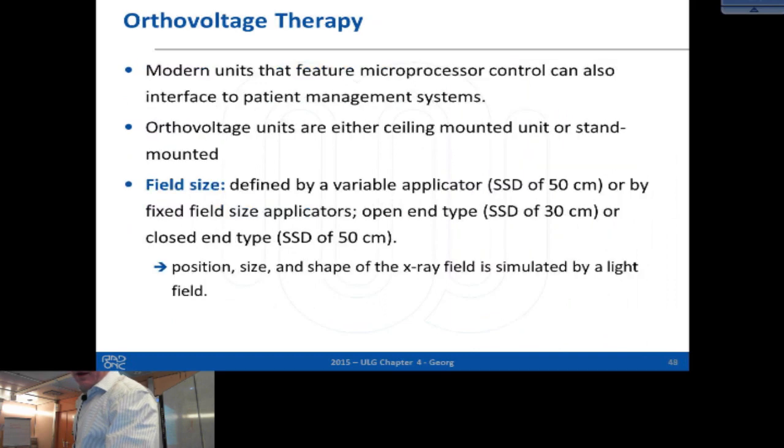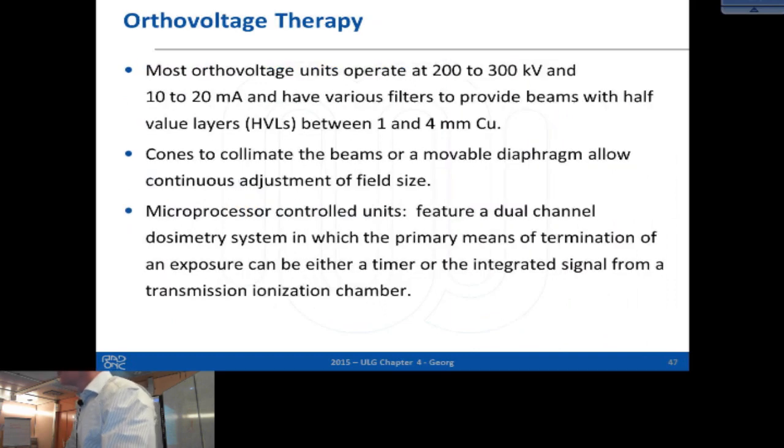So let's go back. Why isn't it used further for intraoperative treatment in a typical brain tumor resection setting? Because you already have the radiation shield room for the intraoperative X-ray imaging.